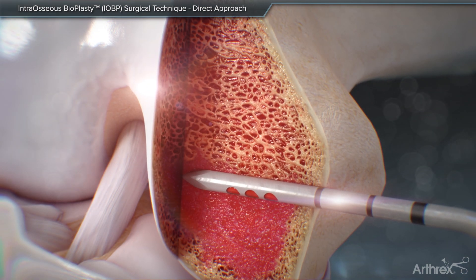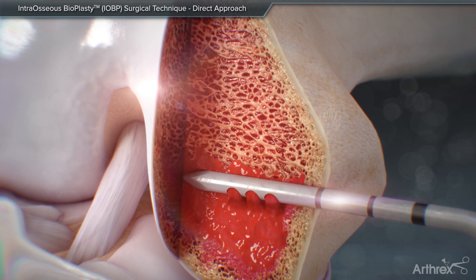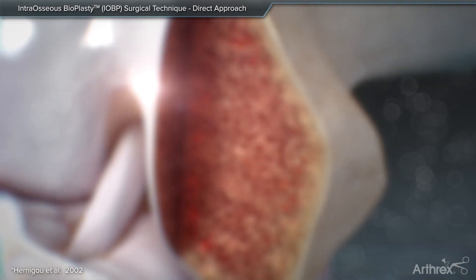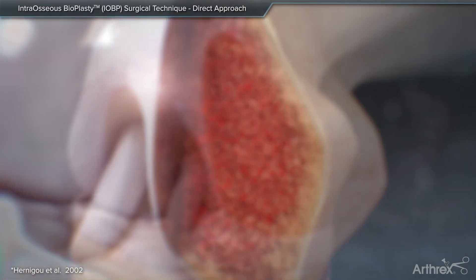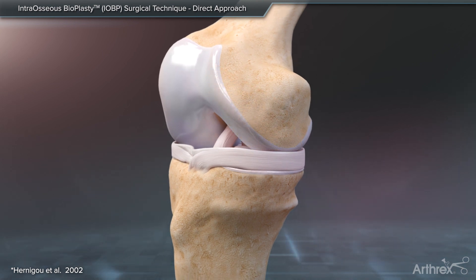The application of Angel BMC, either mixed with DBM gel or delivered directly into the bone marrow lesion, encourages physiological bone remodeling, repair, and additional angiogenesis. Angel BMC, in conjunction with core decompression, helps to restore normal bone anatomy and function.